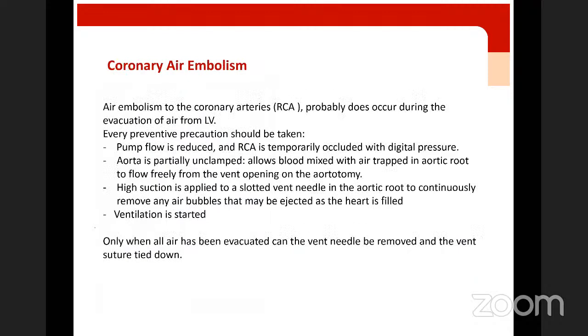Air embolism to the coronary arteries, particularly the right coronary artery, probably does occur during de-airing of the LV. All preventive precautions should be taken to avoid this complication. First, the pump flow can be reduced, and then the RCA is temporarily occluded with digital pressure. Then the aorta is partially unclamped, so the backflow would flush all the air trapped in the aortic root out through the aortotomy incision.